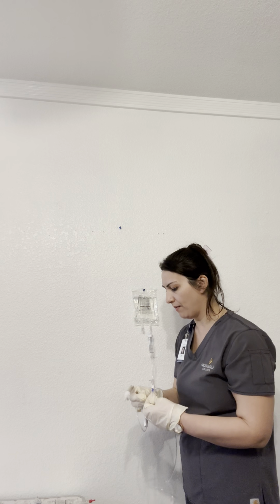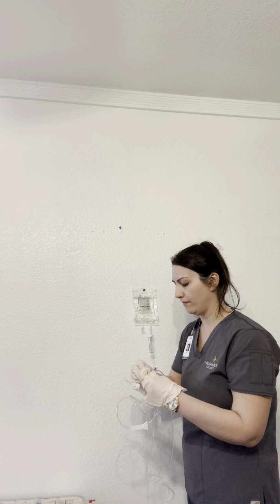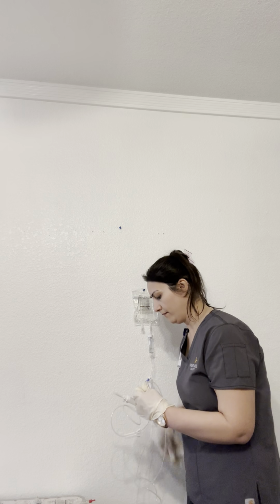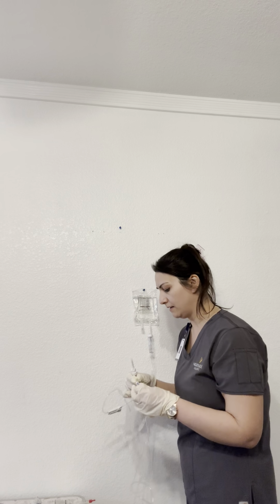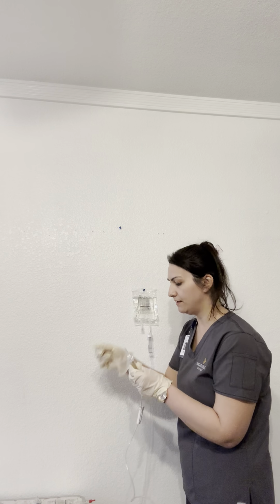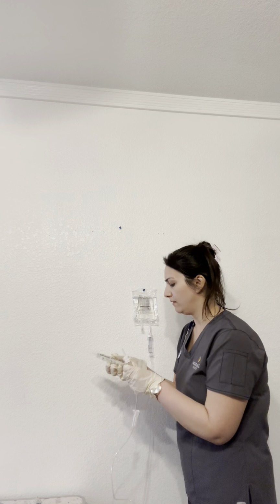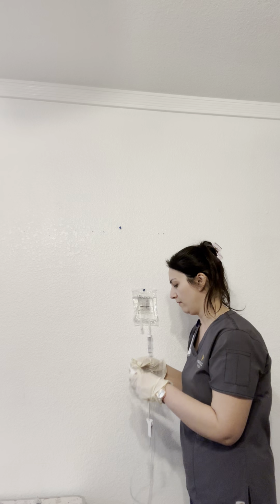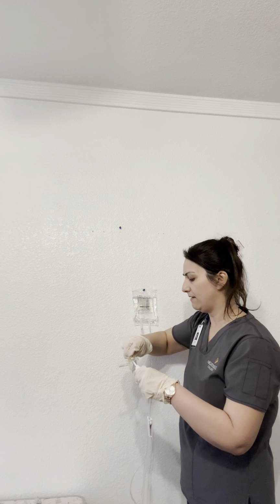I'm going to take the cap off here and connect it to the Y. We're going to take off the spike end cover, take this end off, and twist it in.